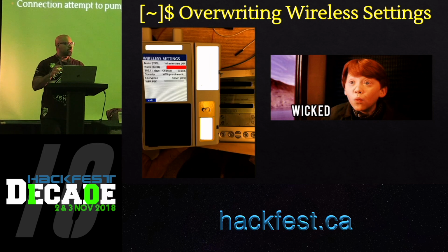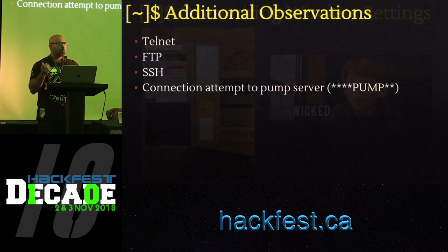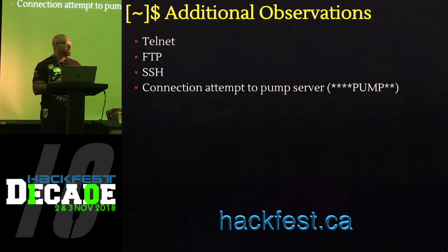We also noticed that as soon as it got connected to the network, it started to look for a pump server. And from our previous knowledge, we knew that Infusion Pumps usually talk to pump servers. So that confirmed what we already knew. But the problem was that we did not have a pump server in our lab.